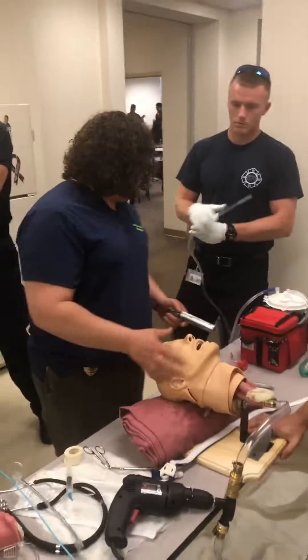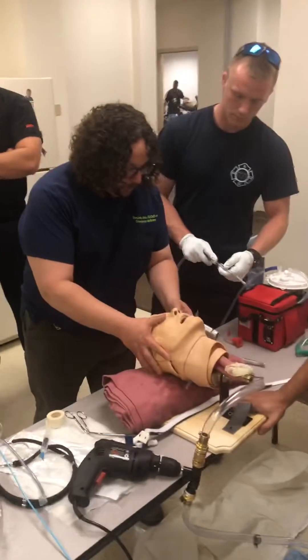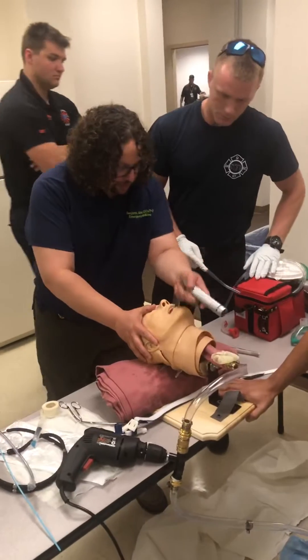Ultimately have you take the bougie out. Ready? Okay, so water will be on, I'm going in — I see a whole bunch of fluid.